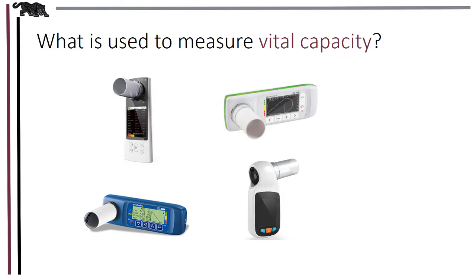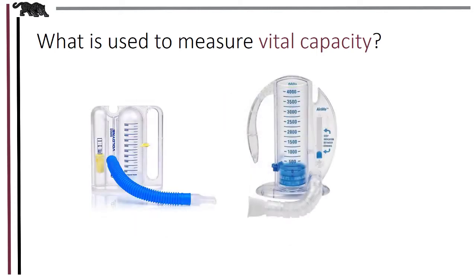You'll even see very simple spirometers that are used in hospitals and rehabilitation settings. And these have adjustable indicators that provide a target for when the client is engaged in their rehabilitation. They know what to shoot for, they know what to aim for. And these types, they're not used for measuring lung volumes per se, but instead they provide a means for exercising the lungs, diaphragms, and associated muscles too.